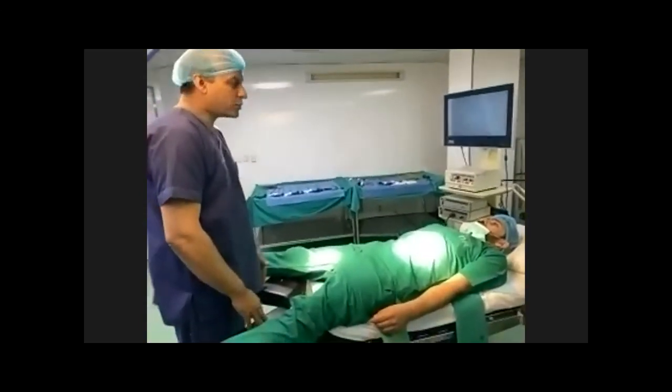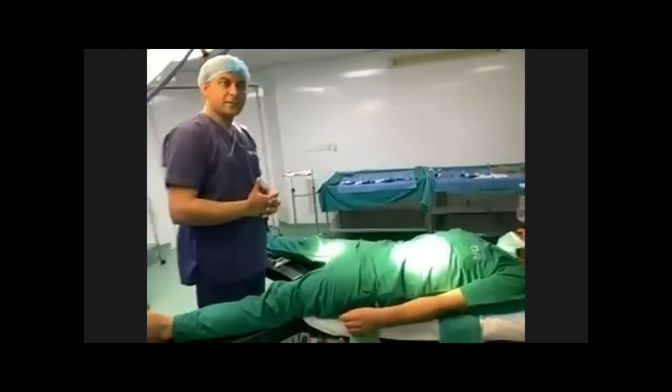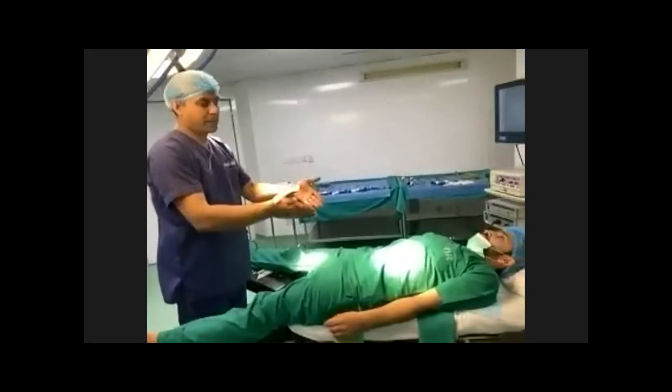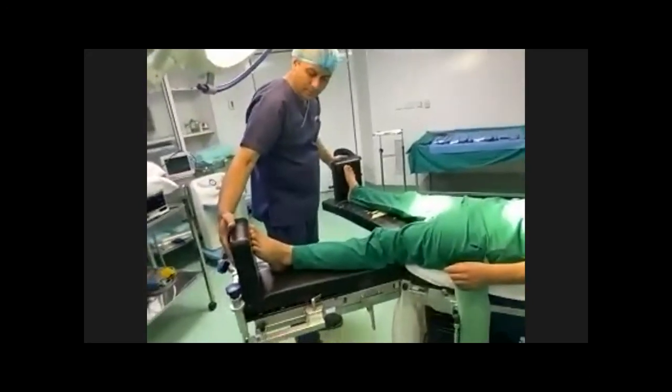Some surgeons even do cholecystectomy in this position, but most of the bariatric surgeons use this French position to do the laparoscopy. This padded foot support is very important. Apply the belts.